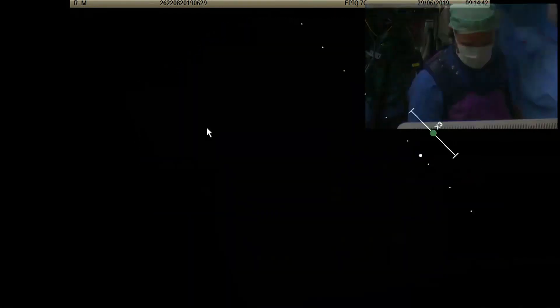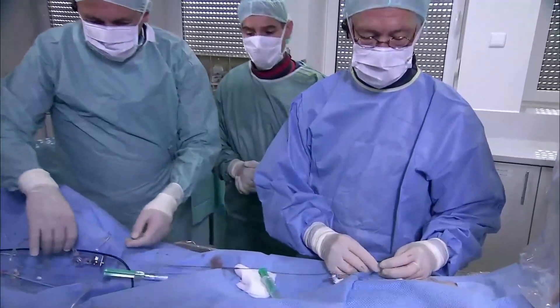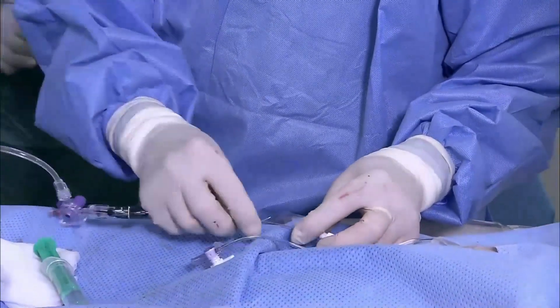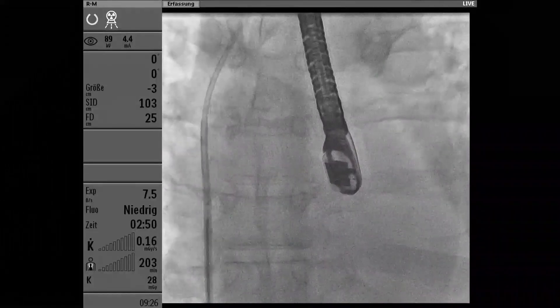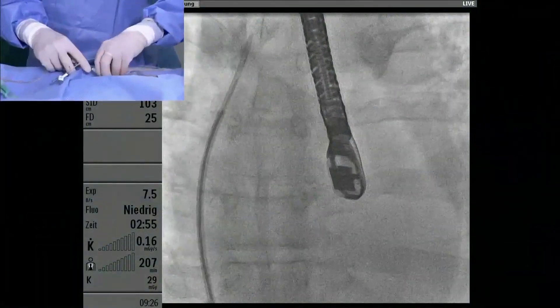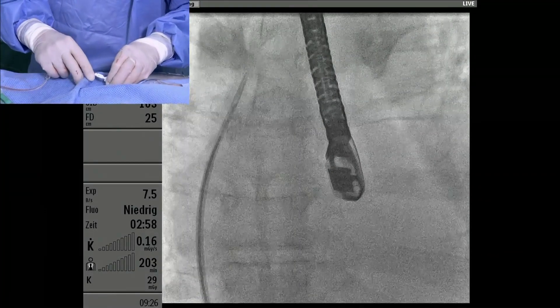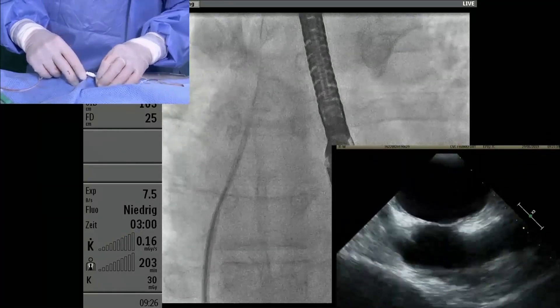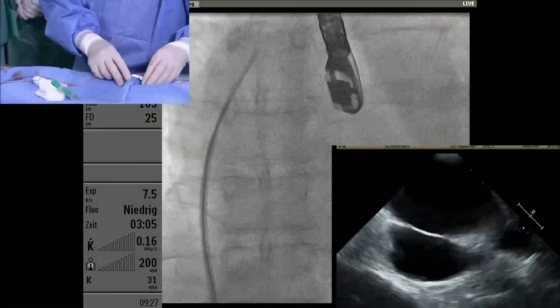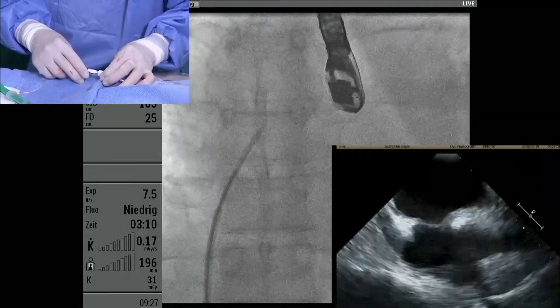Now with the transeptal puncture - the transeptal sheath is in the SVC. I'm inserting the needle now into the dilator. I'm pointing the arrow towards six o'clock or five o'clock. I'm pulling down the system. I need to see echo on my screen here as well. I'm looking for the tenting. I'm very high up, so I'm going down. I can see the tenting.